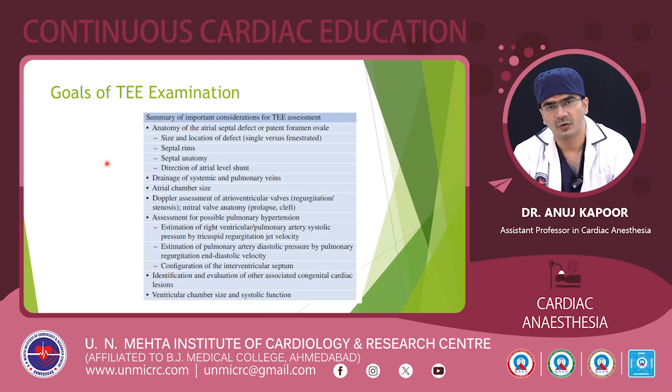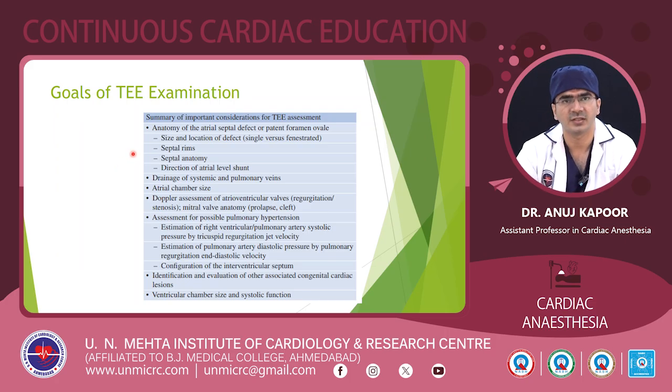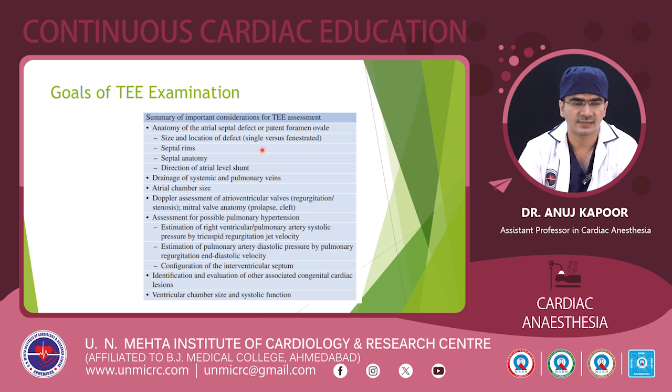Now we will go forward to the goals of our TEE examination. First of all, we will have to evaluate the anatomy of the atrial septal defect or patent foramen ovale, and in that the size and the location of the defect. Size is important to assess the amount of shunting that is happening, and the location of the defect.